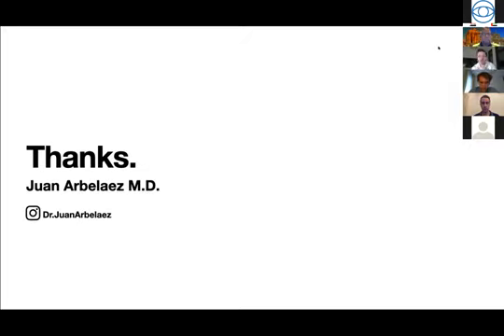So not an average, check the exact location where the cornea is thin, that you can do very easily using the ring software of the MS39. Yes, thank you.